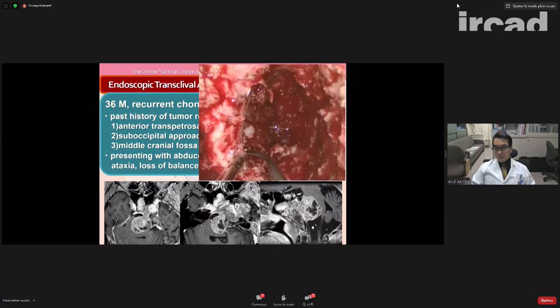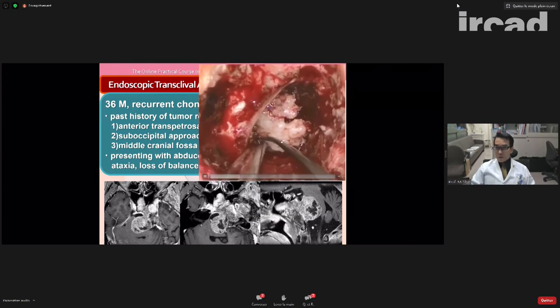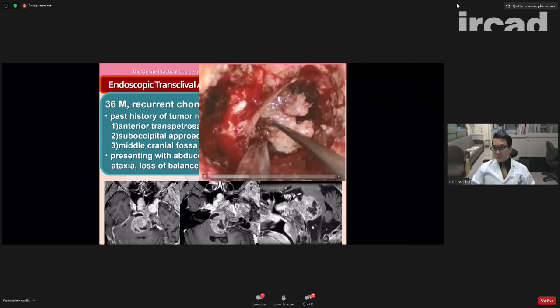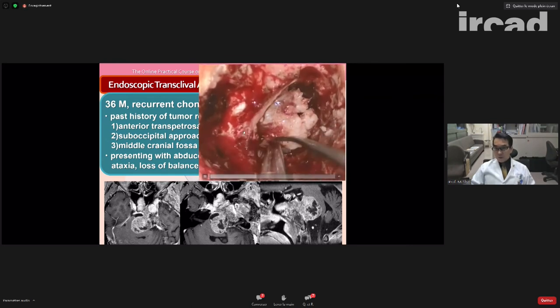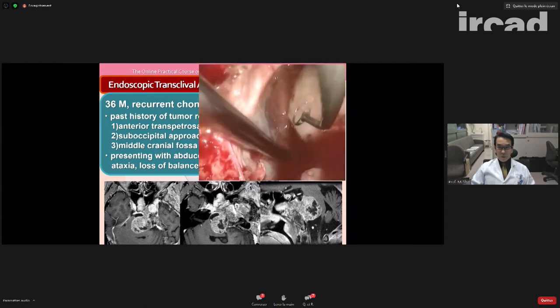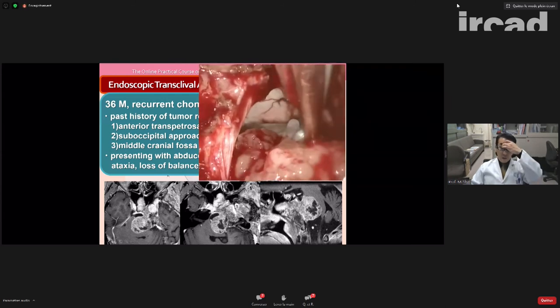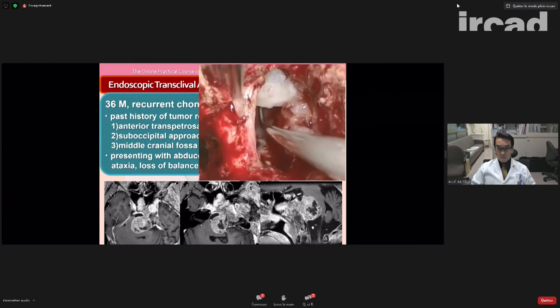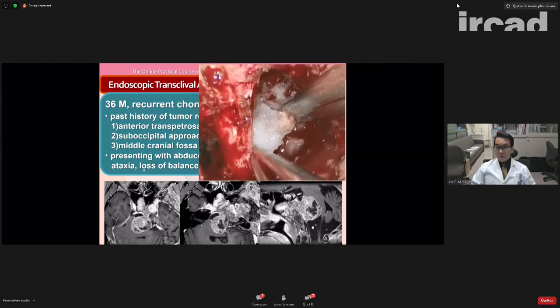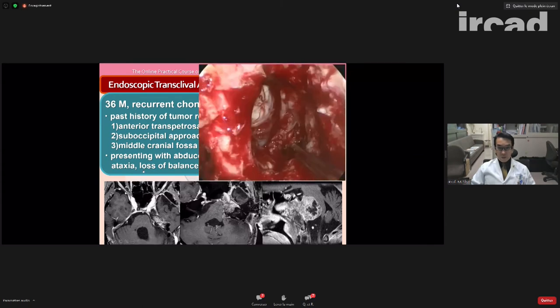So this is a recurrent chondrosarcoma, and we use the same technique. We should first do the mass reduction, then we dissect the tumor from lateral to medial, like this. And with piece by piece resection, we can effectively remove the tumor without brainstem damage. Like this.